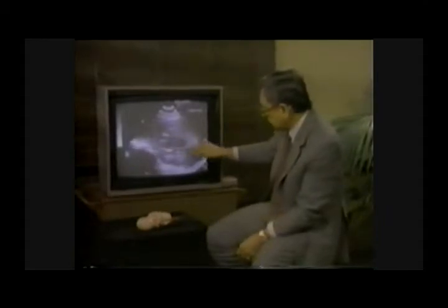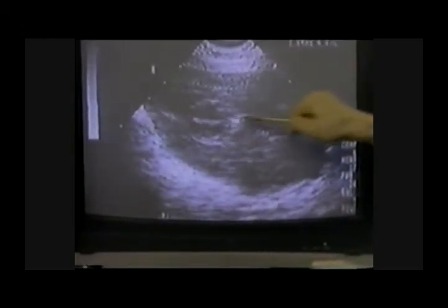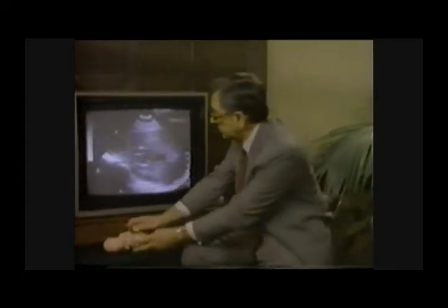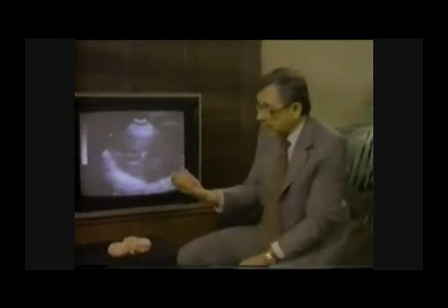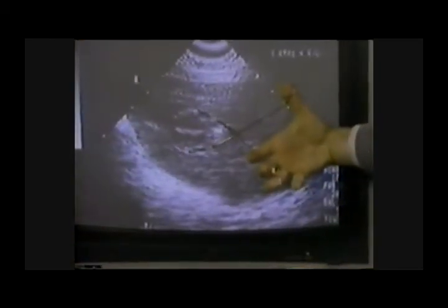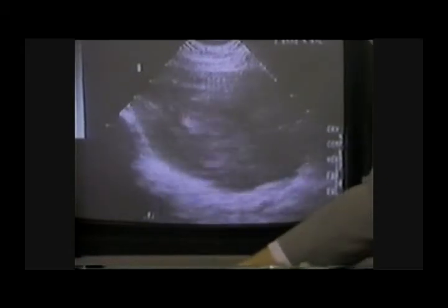The child's head is still discernible here. The body is no longer discernible. It has now been torn from the head. What we see now is the head itself with what is called the midline echo of the head and the spicules or fragments of bone. Now, this head, which I'm outlining here, on this 12-week child is simply too large to be pulled in one piece out of the uterus. The abortionist is going to have to employ this instrument, the polyp forceps, in an attempt to grab the head. The abortionist will attempt to crush the head with this instrument in this manner and remove the head piecemeal from the uterus.